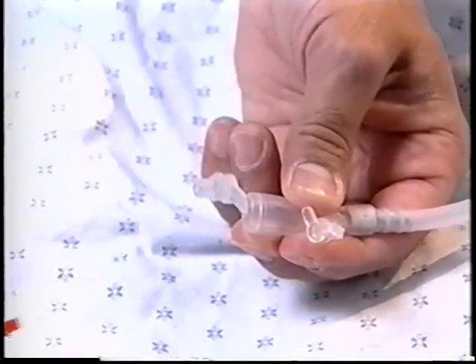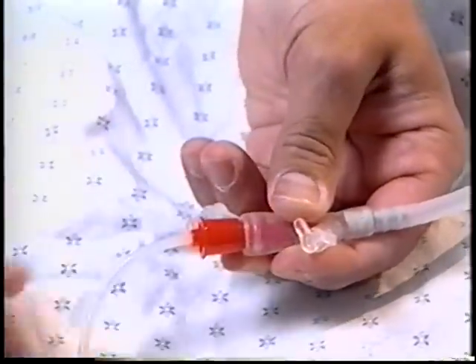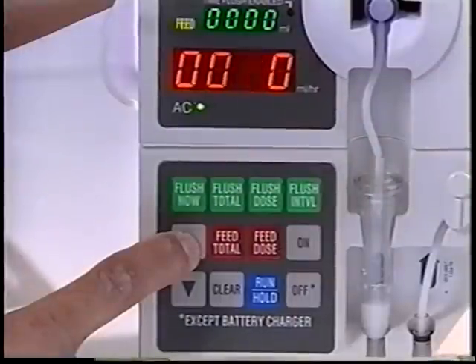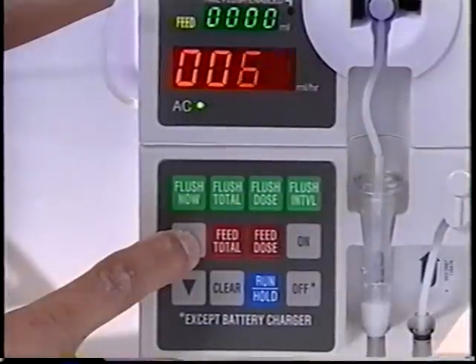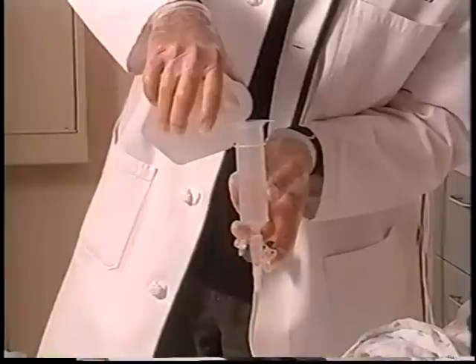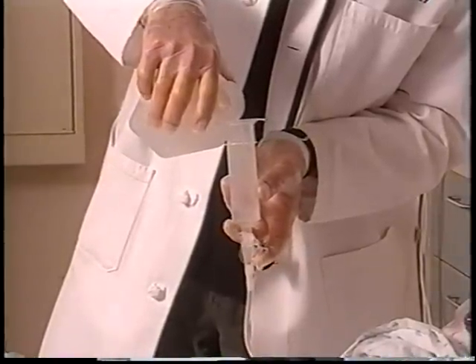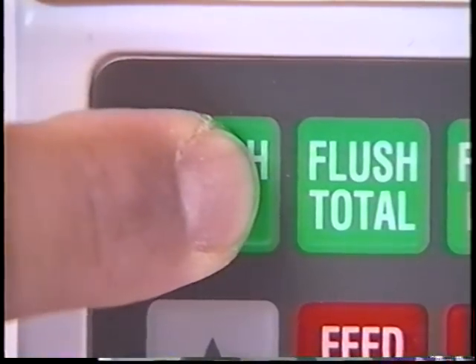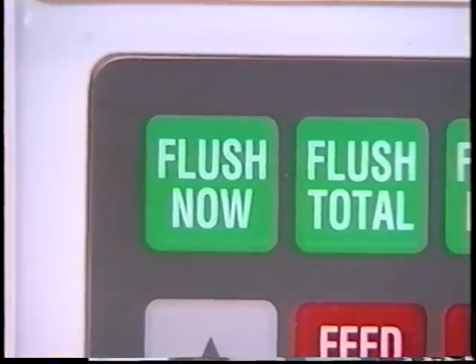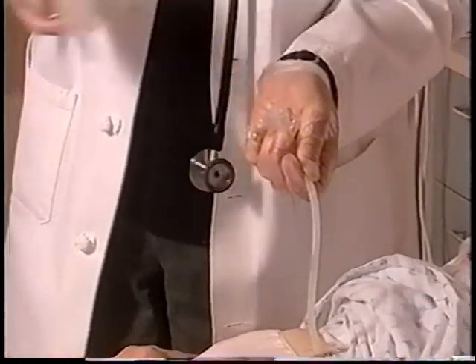Continuous feeding requires use of a feeding pump. After the tubing is attached, the pump is turned on and regulated to allow the formula to flow at the prescribed rate. The amount of water the patient should receive with the tube feeding is also prescribed by the physician. This can be delivered via the bolus method with the syringe or through the pump. Water delivery will both provide hydration for the patient and prevent clogging of the tube.